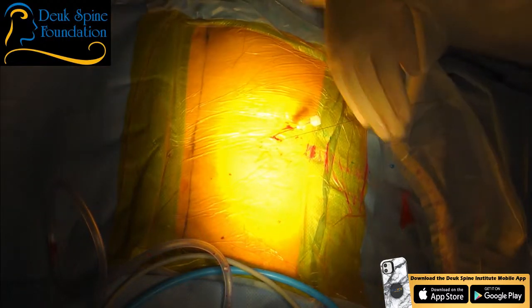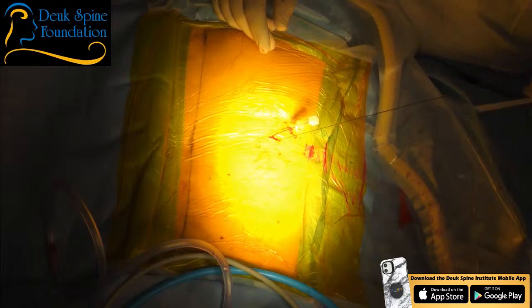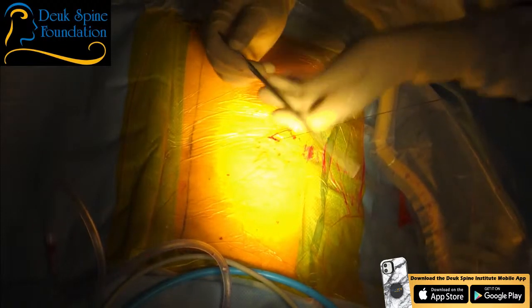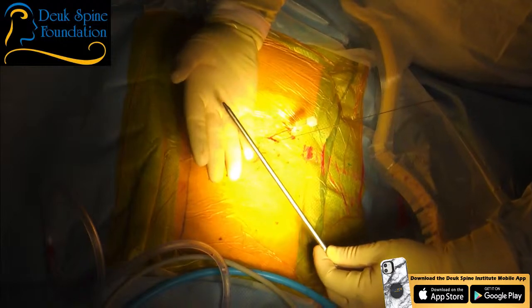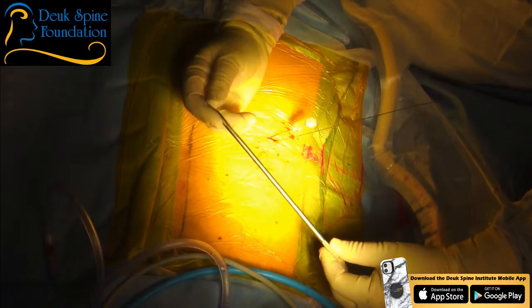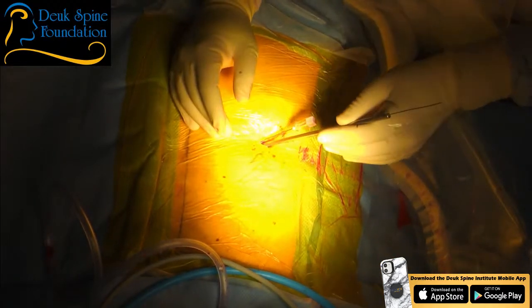So now we use this beautiful guide wire to guide us from the skin down to the disc. All right? So can you guys see this, Sean? You want to show our viewers what it looks like? Yes, we can. It looks like a long metal pencil, but it's got a hole in the end, and that hole allows it to pass over the guide wire into the spine.